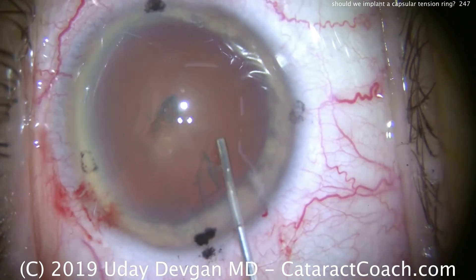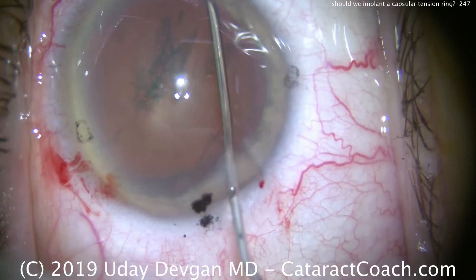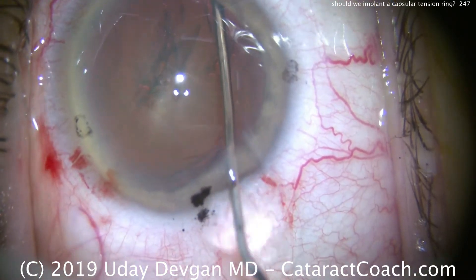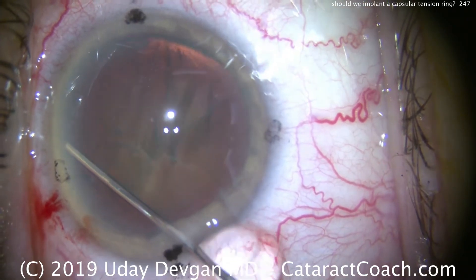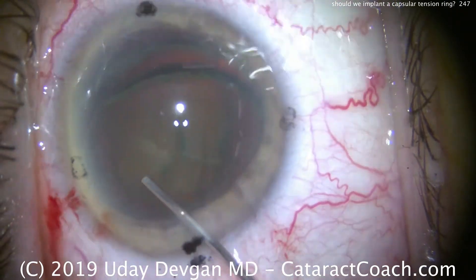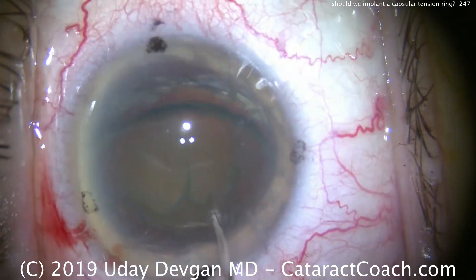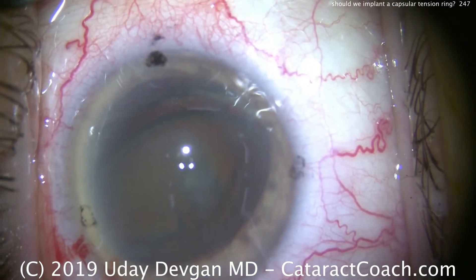We'll do some hydrodissection and hydrodelineation. The goal here for me is to get the lens out of the capsular bag. So slow and steady with the hydrodissection with a sufficiently large capsulorrhexis. There's the nucleus — let's hydrodelineate. We're going to chop this above and outside the capsular bag, because I think it'll put less stress on the capsular bag.